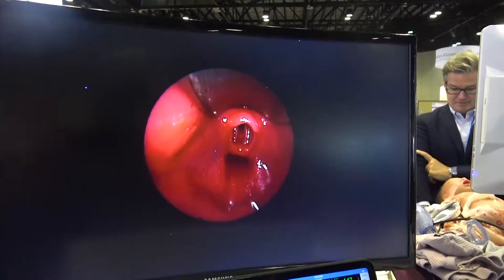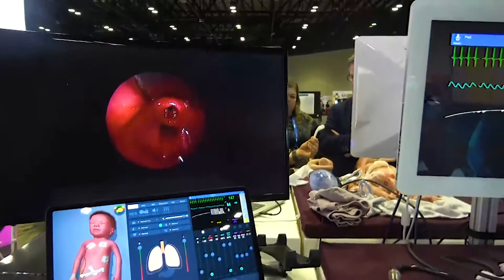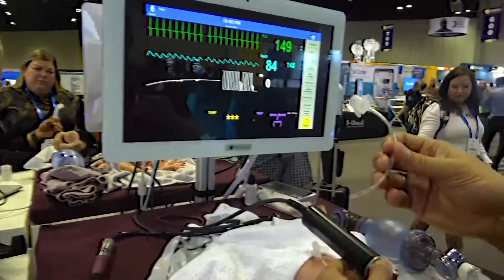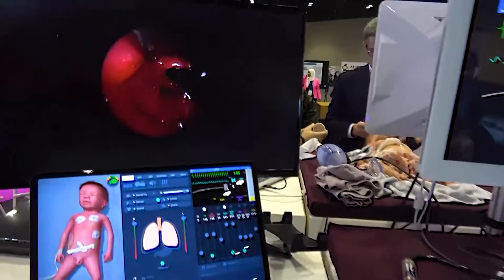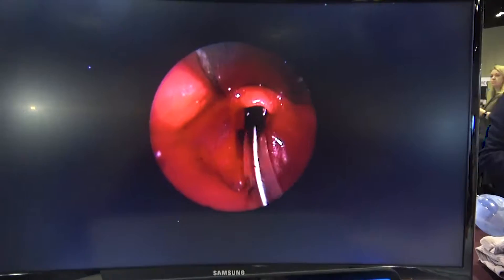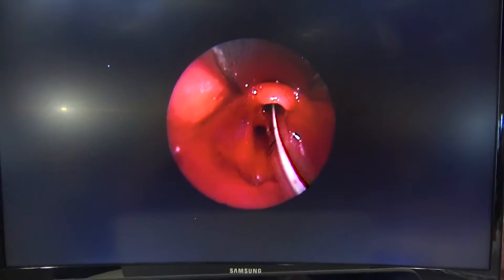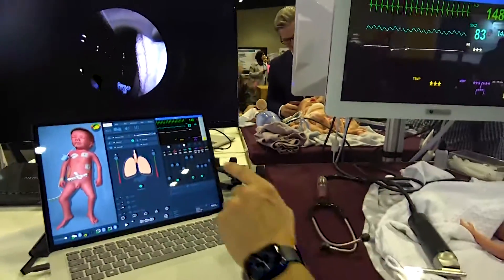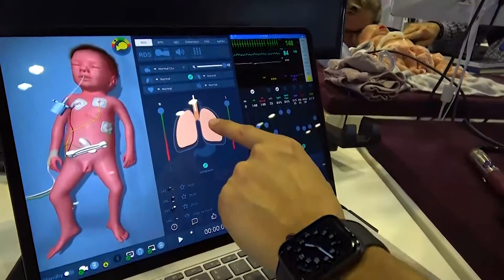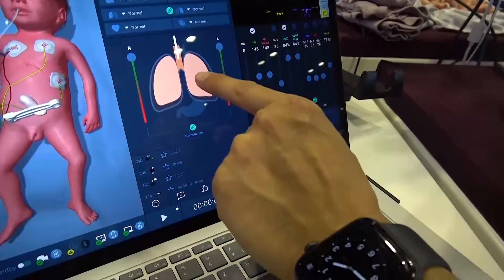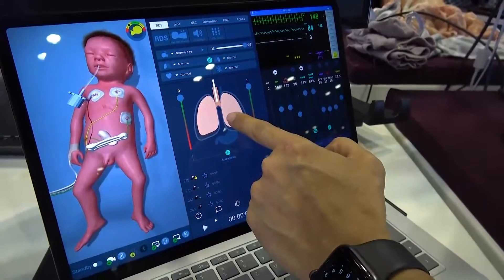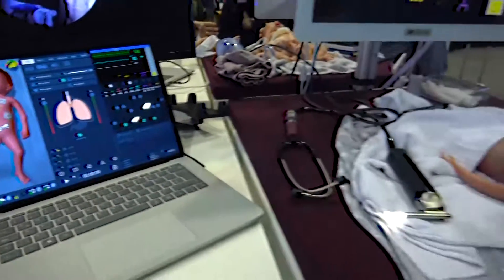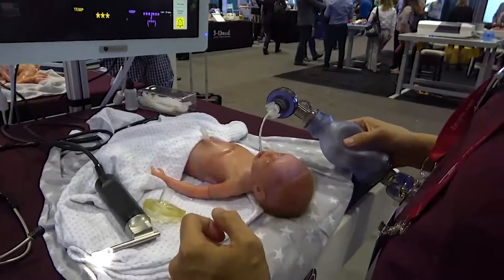It barely looks like an airway like it does in a real baby. I put in a 2.5 tube. I'm going in, and now you can see real time — I'm intubating Paul now. The great thing is in the simulator, we as instructors can see where the tube is, how far it is in, or for example if I'm in too deep. If I correct it, I have real-time feedback and I'm ventilating him.